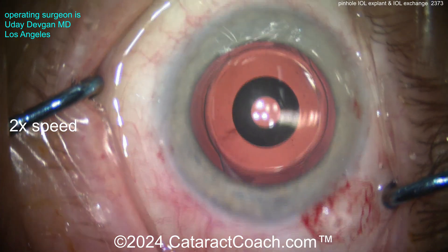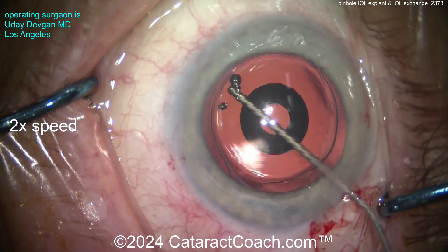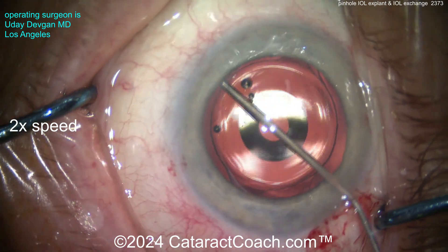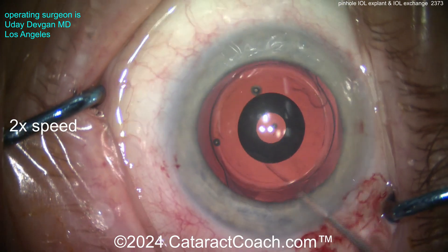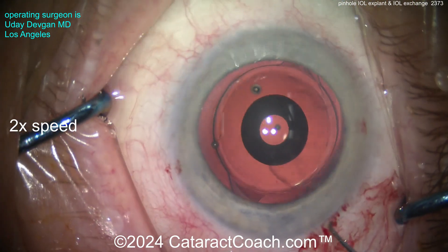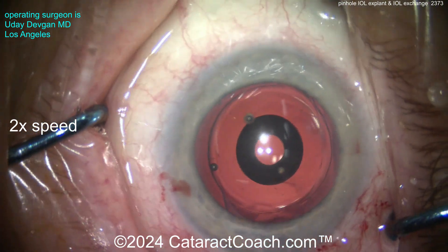He's using a Sinski hook to try to get that lens freed up. You saw how we injected viscoelastic underneath the anterior capsular rim. Using a dispersive viscoelastic to visco-dissect the capsular bag open. The goal here is to separate the anterior and posterior leaflets of the capsular bag, opening it very gently, and we want to preserve this capsular bag.